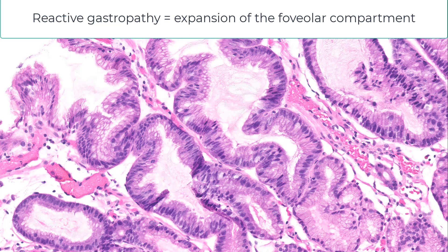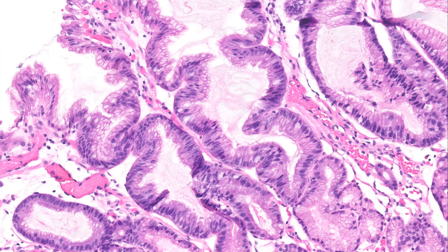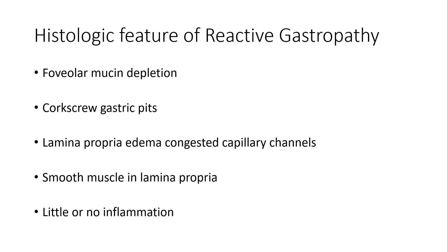The foveolar compartment expands so much that it collapses on itself, and that is how the serrated architecture is created. So the five features of reactive gastropathy are: loss of mucin, the serrated corkscrew appearance of the pits, lamina propria edema and congested capillary channels, smooth muscle proliferation (which was not present in this case), and by definition, very little or no inflammation.